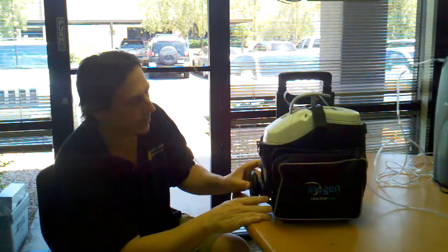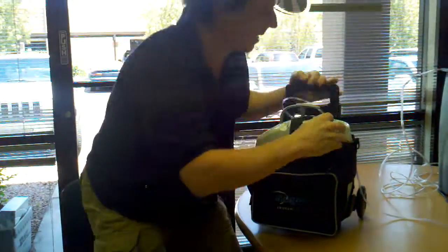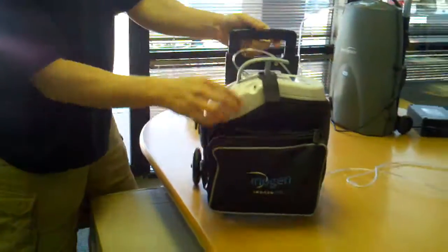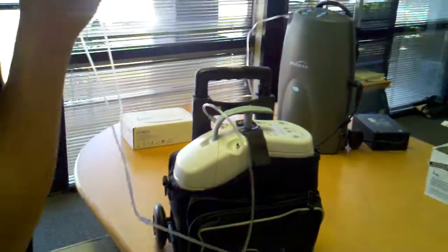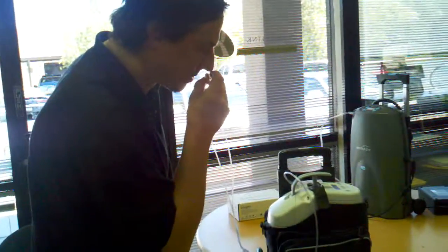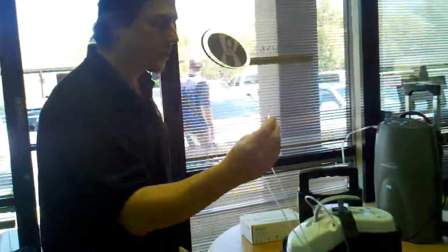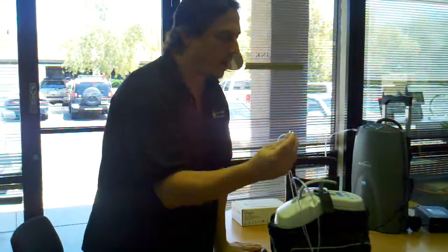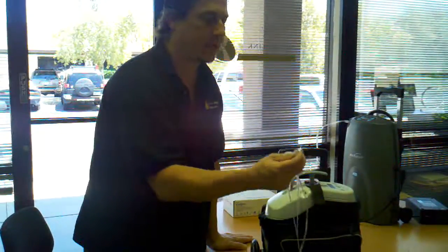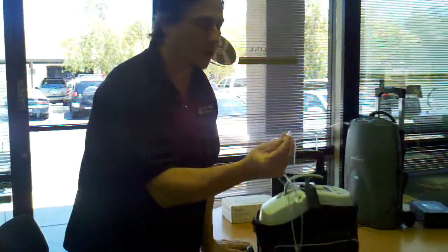There are two categories. There is the pulse dose, which we call on-demand. When I turn this on you will see what I'm talking about. Every time you breathe, it's going to give you a burst of pure oxygen — 90 percent medical grade oxygen. It's not a continuous flow. You cannot bleed this into a CPAP. It's only for people recommended by their doctor who can handle below three liters of a pulse dose.